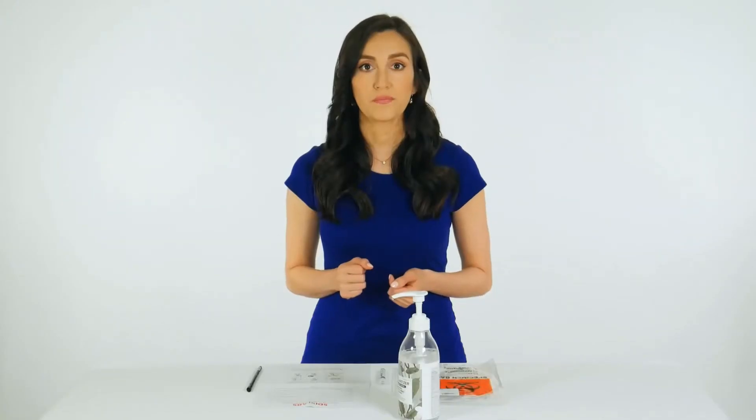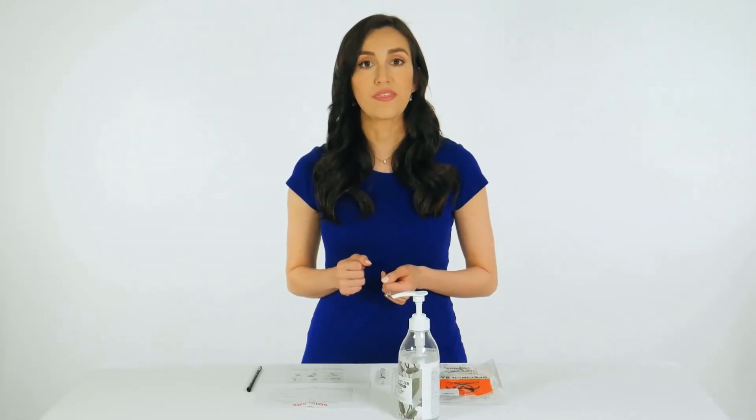Carefully insert the swab into your mouth. Swab your tonsils on both sides of your mouth, unless your tonsils have been removed, and the back of your throat. Then withdraw the swab without touching your tongue.